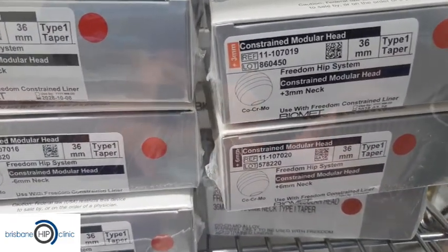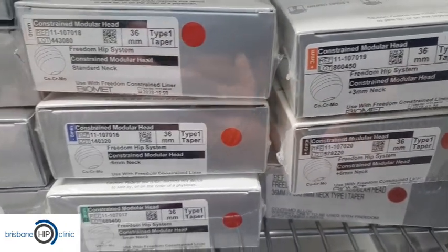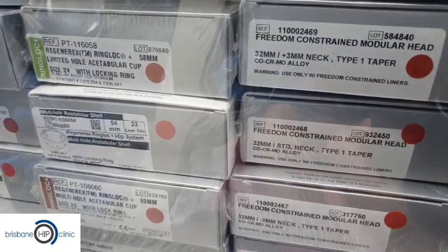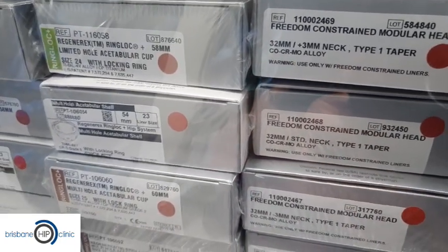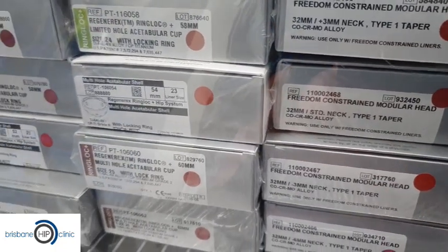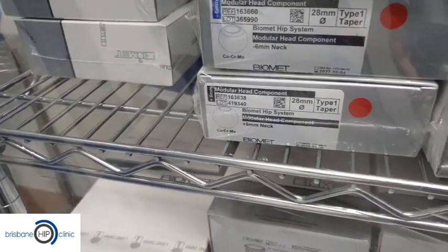Here's an example of a constrained head, which is one that actually locks into the socket to prevent dislocation for people who are at high risk. There are also different bearing types — for instance this is a metal head made of a cobalt alloy — and we also have ceramic options, here are examples of the ceramic heads.